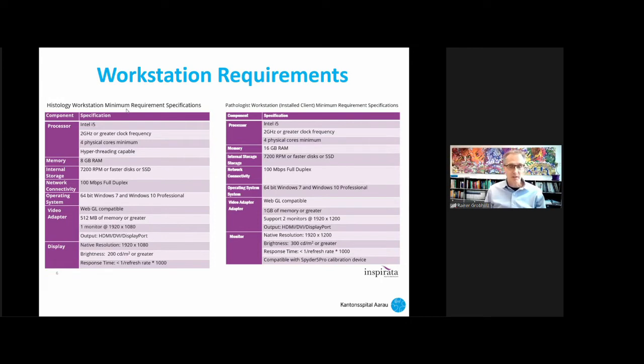And as you see, monitors have been a very big topic in the past. Here, these are the requirements for our digital pathology system. And if you look here, it's really not that big of a deal. So we tried various monitors with all calibrations, automatic or manual, or resolutions and pixels. And at the end of the day, we found all of these monitors are suitable. So depending on what kind of preference you have, you may choose the minimum or a high-end monitor whenever suitable.